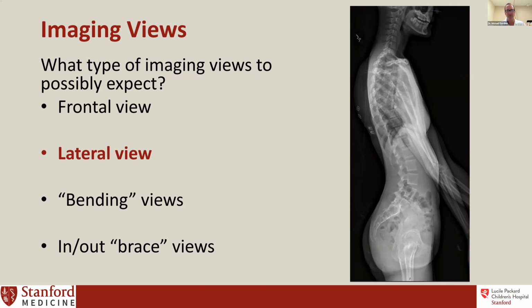Like Jesse gave a great overview on the Risser or the hand, there are other ways to assess. Sometimes age is a good surrogate too, but I think it's reasonable to make sure your physician is accounting for the skeletal age of your son prior to getting a bunch of X-rays.